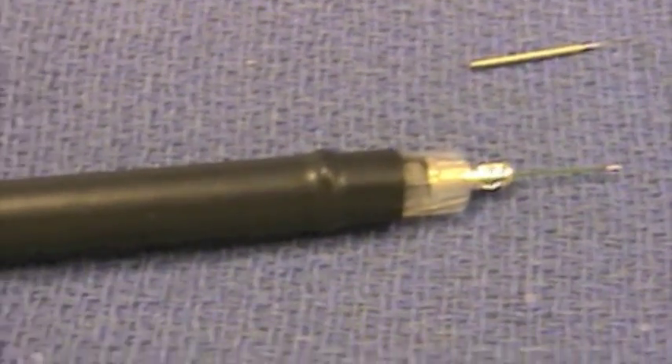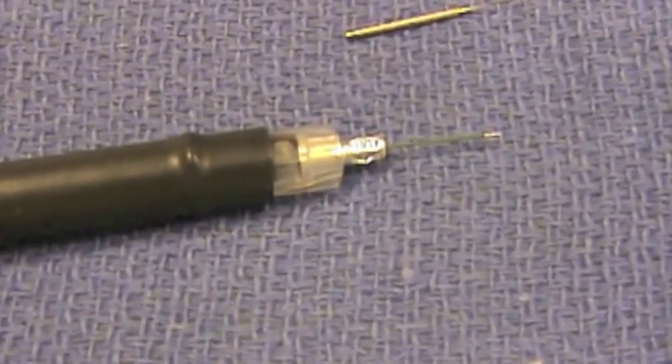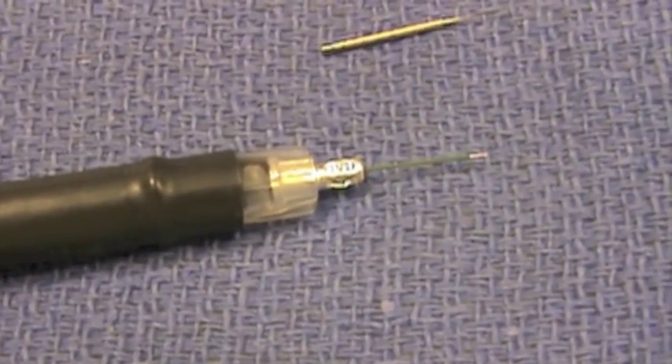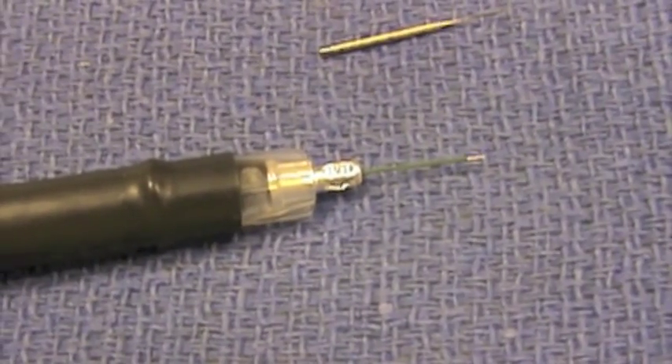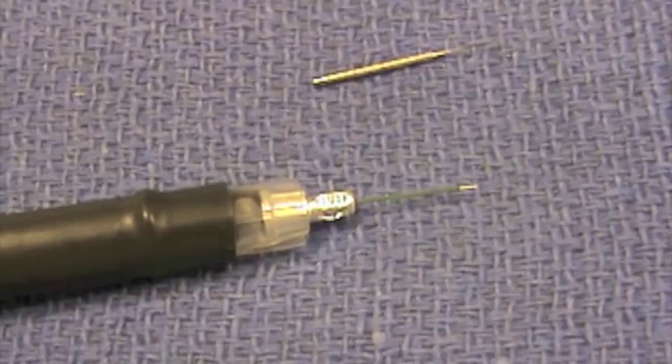You can see this is the needle — it's got a nice hub on it and a long connecting piece. We're going to show you how to use it in just a minute, but first I want to show you how you hook it to the machine and the settings we use.